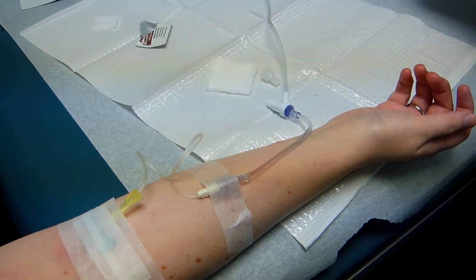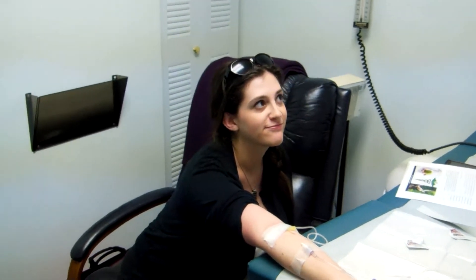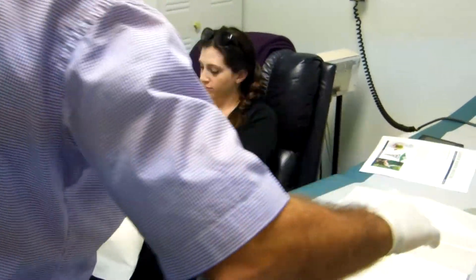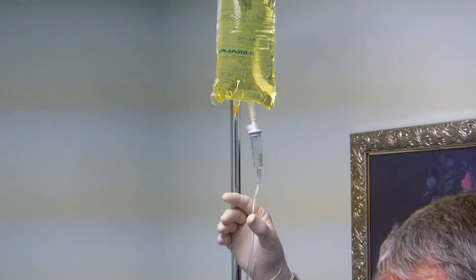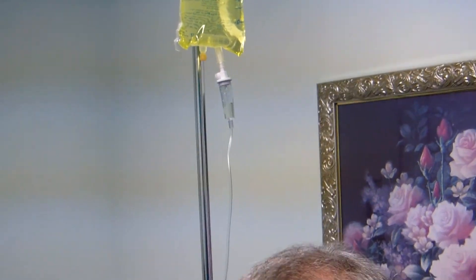Then she will be hydrated. So relax — here's a pillow to put your arm on. You've got plenty of cord here. Flowing wide open. That'll take about 55 to 60 minutes to run in.